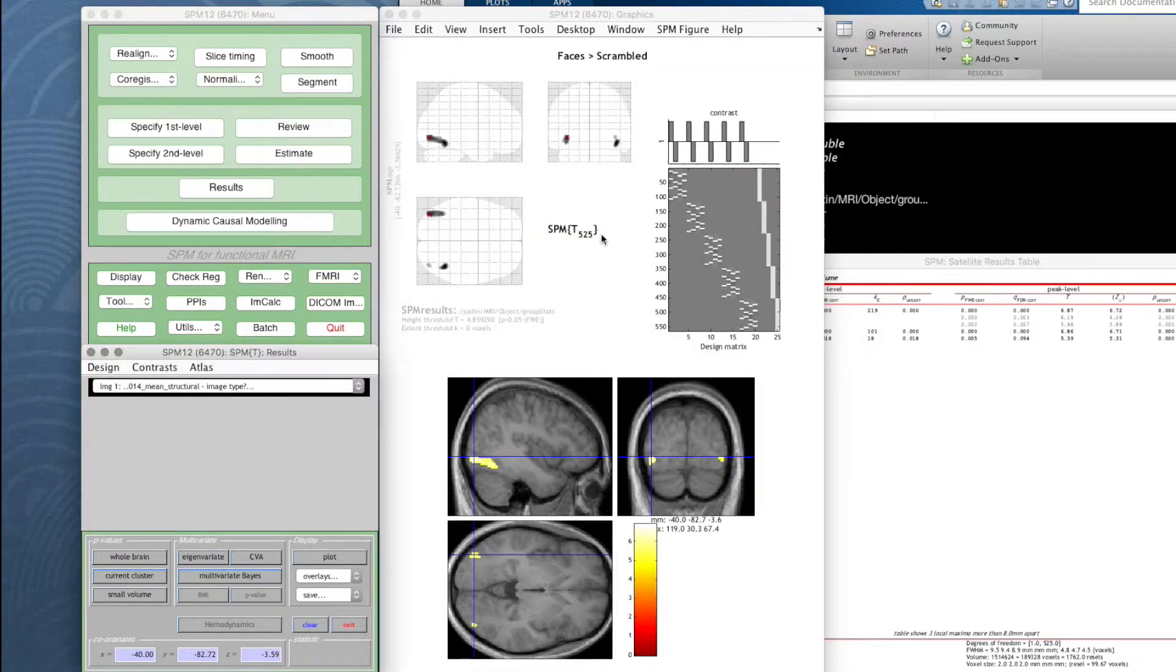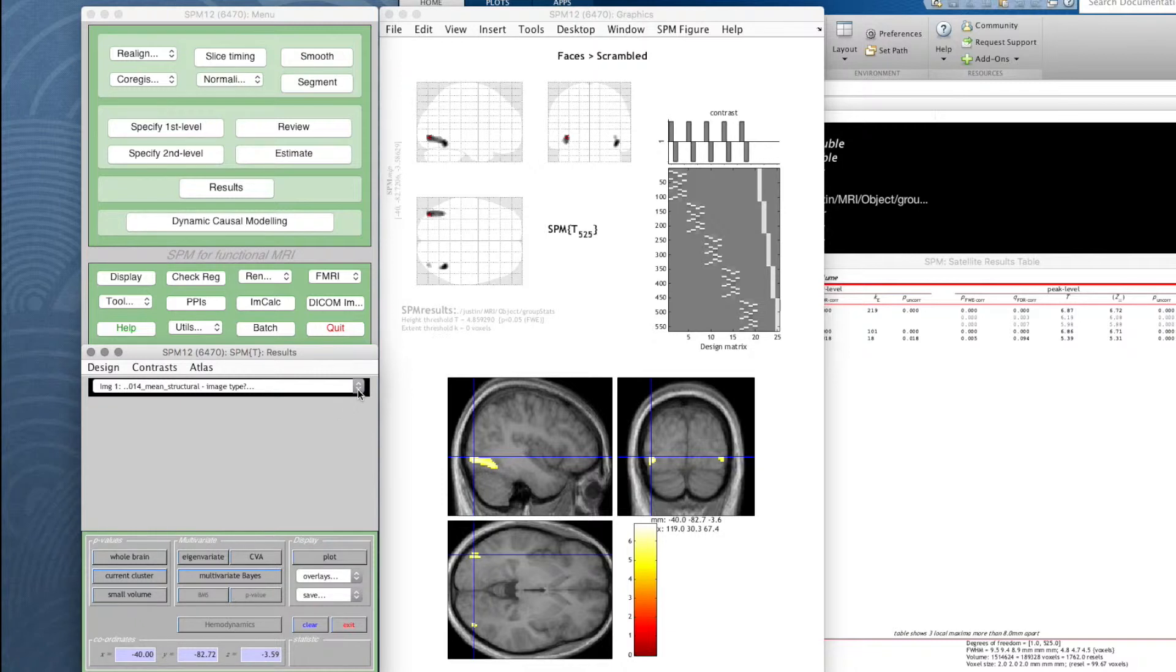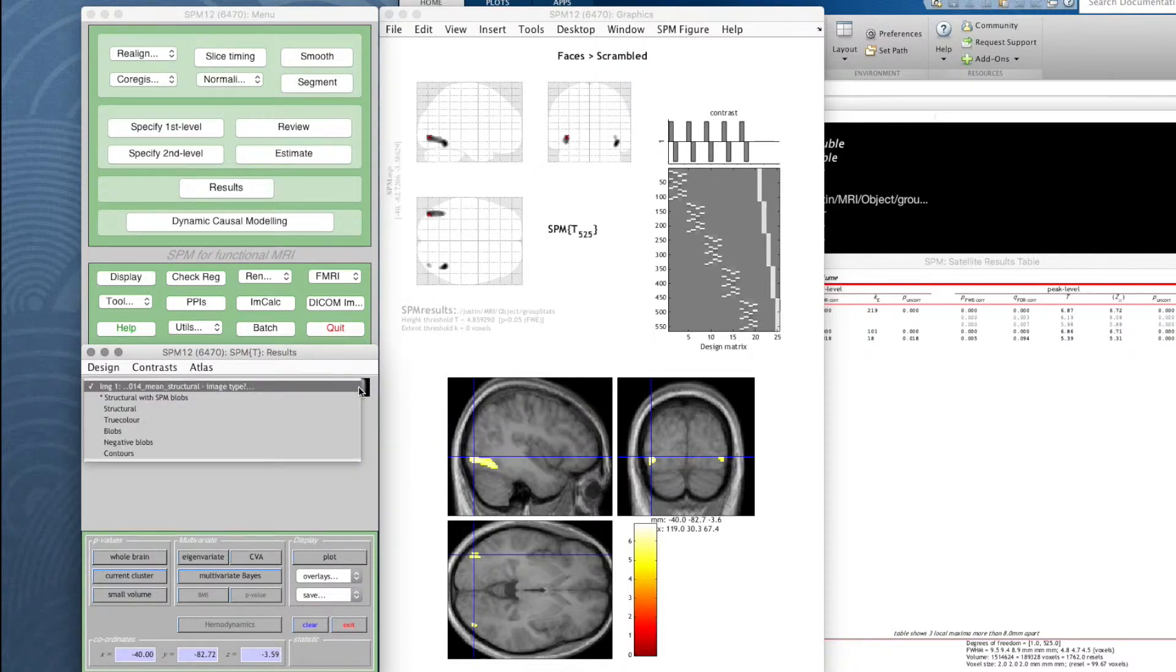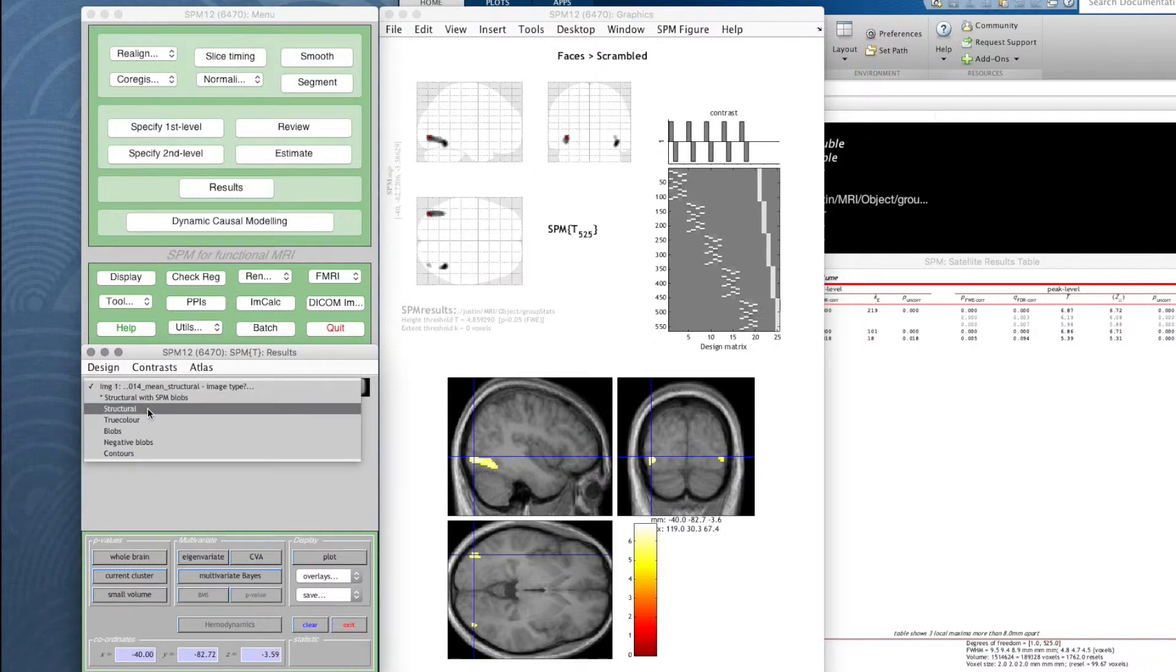In this window it asks us what are those images, what type of images they are. So the first image, the mean structural, is just a structural image. The second image, faces minus scrambled, we call blobs or thresholded SPMs.